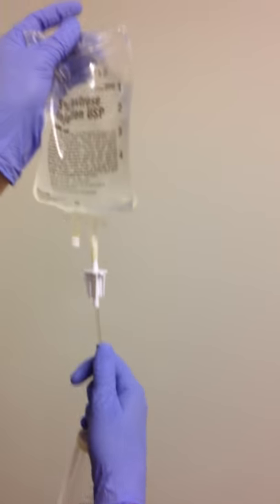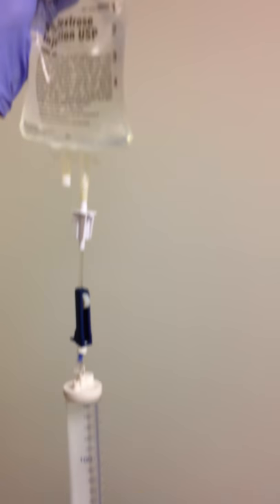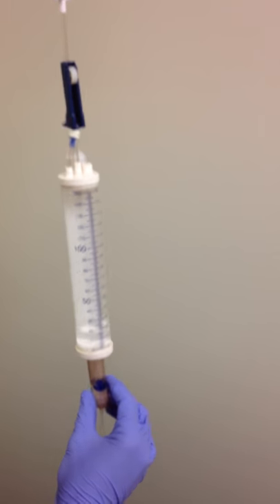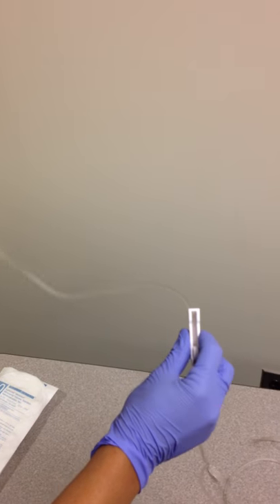We're going to spike the bag like we would any bag. There'll be a bag of D5W, a thumb wheel, the metered dose chamber, the drip chamber, and the line that goes to the patient with the second thumb wheel.